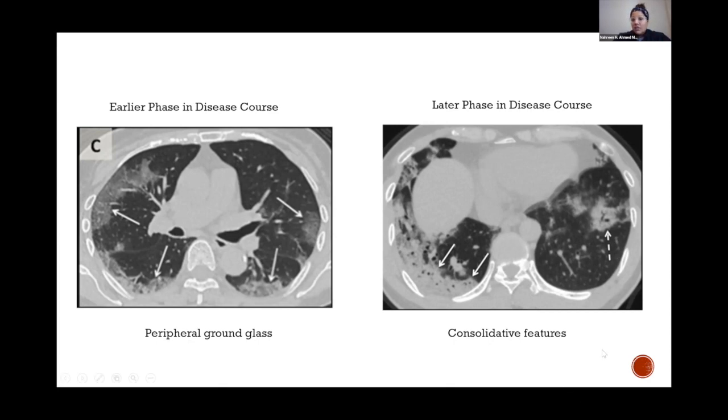However, to be very transparent in the POCUS world, we're still really studying this to see how useful this is when we're taking care of patients on the floor. Does it matter that we're seeing ground glass versus consolidation? To some extent, it probably does. But the issue is that a lot of the data we're getting from the Italian folks too is that this disease is so unpredictable.